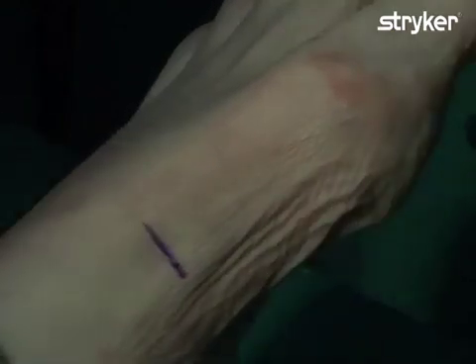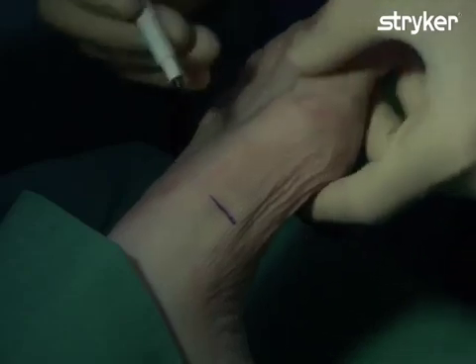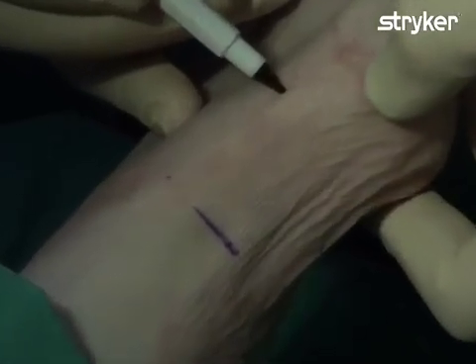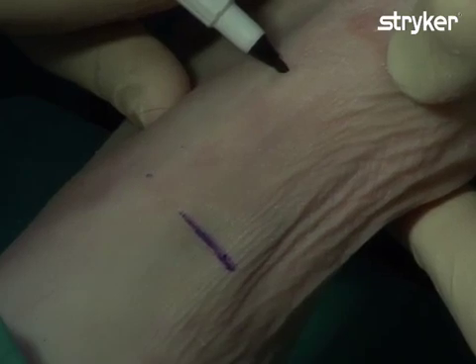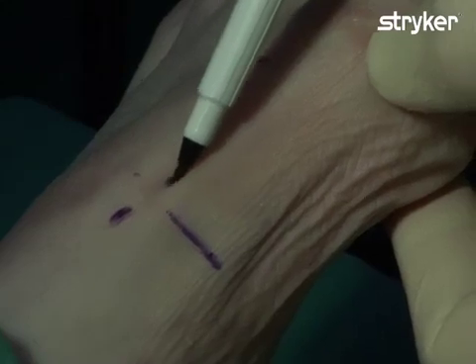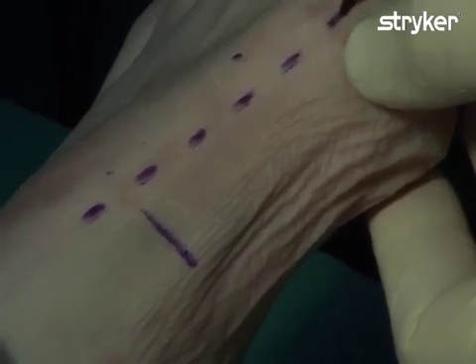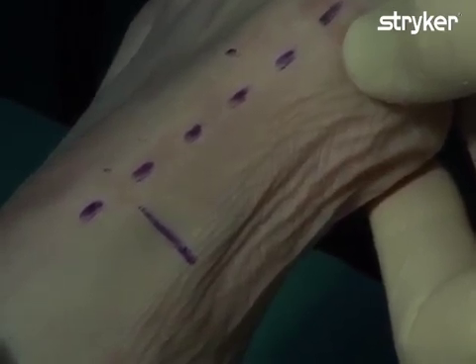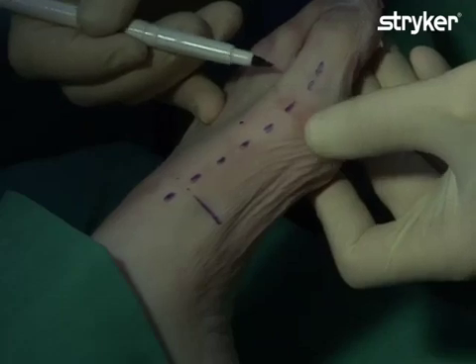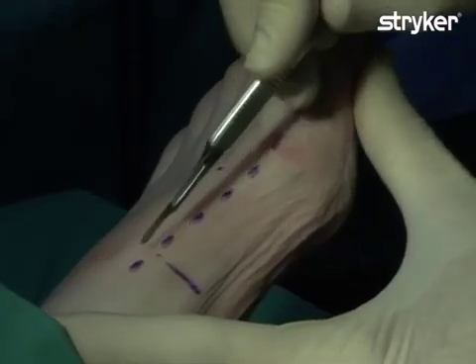The extensor tendon and the medial eminence are used to determine the location of the skin incision. The incision is placed just medial to the long extensor tendon, between the extensor tendon and the medial eminence. In addition to fusing the first metatarsal cuneiform joint, we will also perform soft tissue adjustments distally at the metatarsal phalangeal joint, including a lateral release and a medial capsule repair.